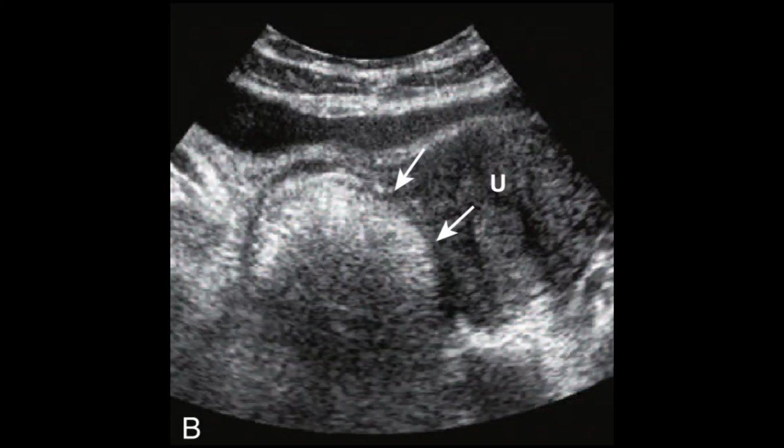This is a transabdominal scan of the pelvic area. The U is indicating the uterus, and this is the right adnexal region. In the right adnexal region, indicated by the white arrow, you can appreciate a well defined, highly reflective, highly attenuating mass lesion. Only the surface part of the mass is visible, because all this area has increased echogenicity, and because of this increased echogenicity, the lower part is obscured.